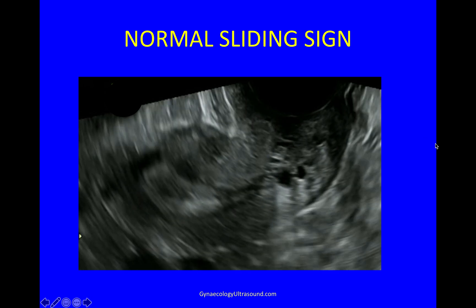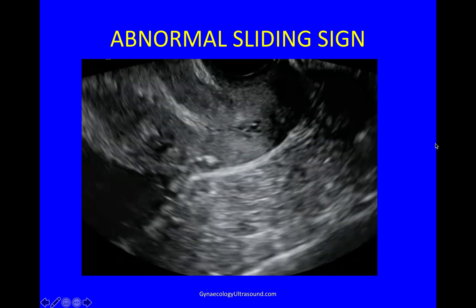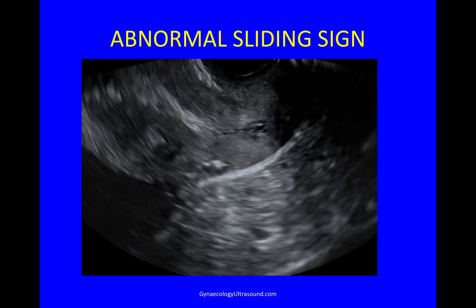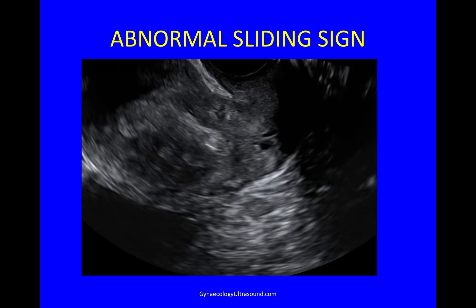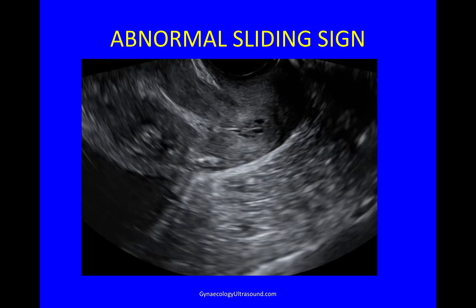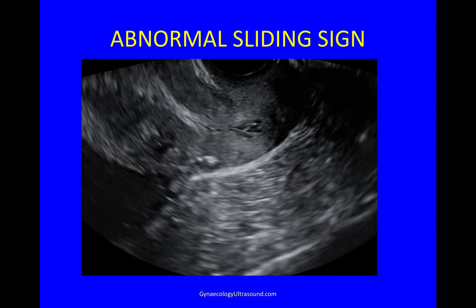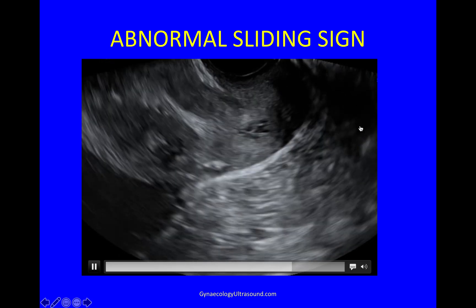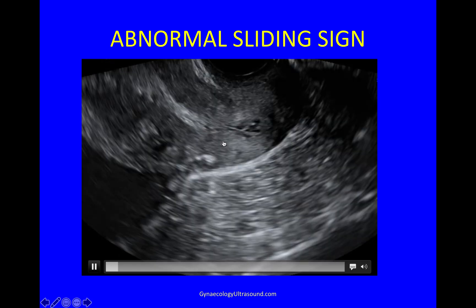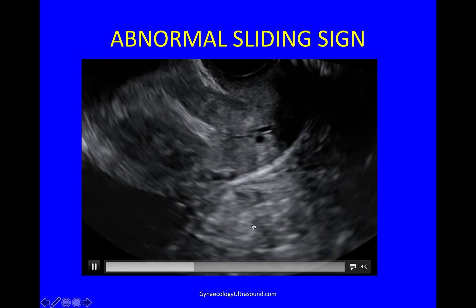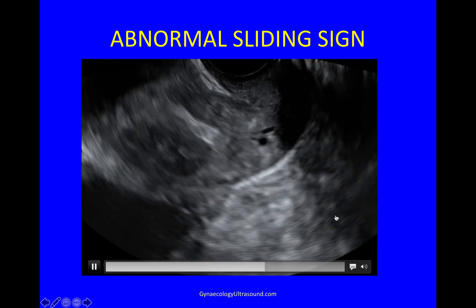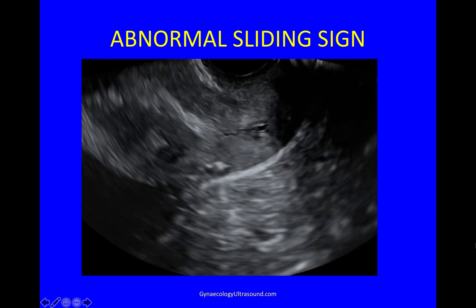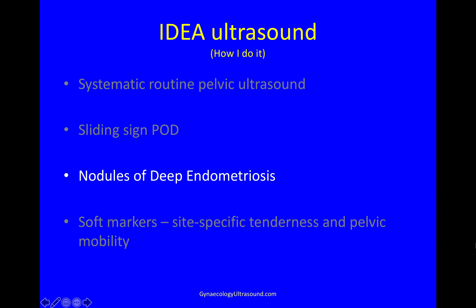This should not hurt. Compare that to an abnormal sliding sign, where with very gentle pressure there's movement, but everything moves together — the uterus, the ovary, and the bowel — it's all glued together. That is an abnormal sliding sign.